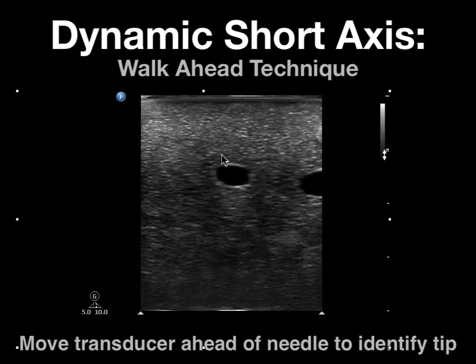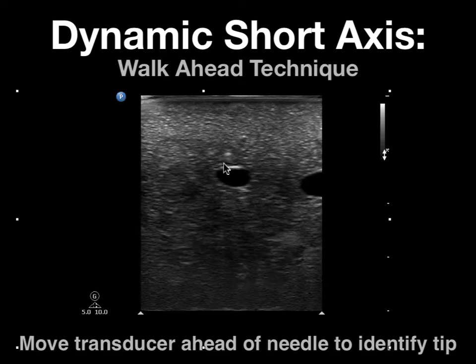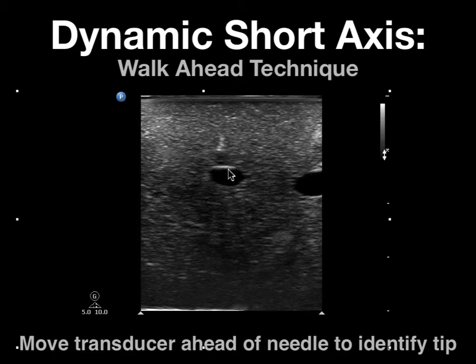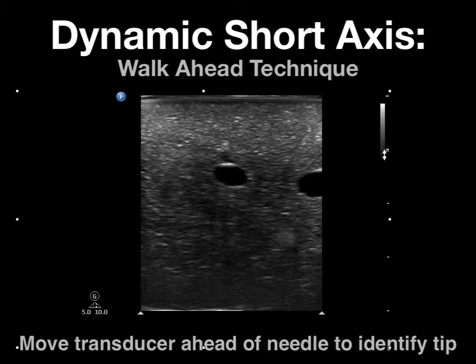So you can see there's the needle tip, we lose it, I come back to it, I know then that that's a tip, get closer to the vessel, walk ahead of it and come back. So practice this technique on a phantom. I think you'll find this to be very helpful.